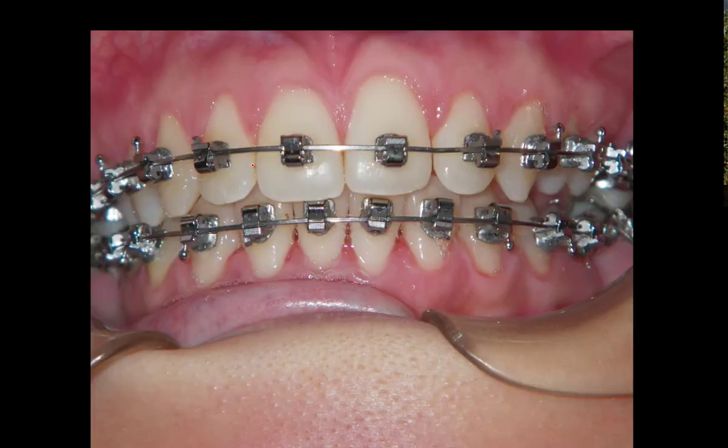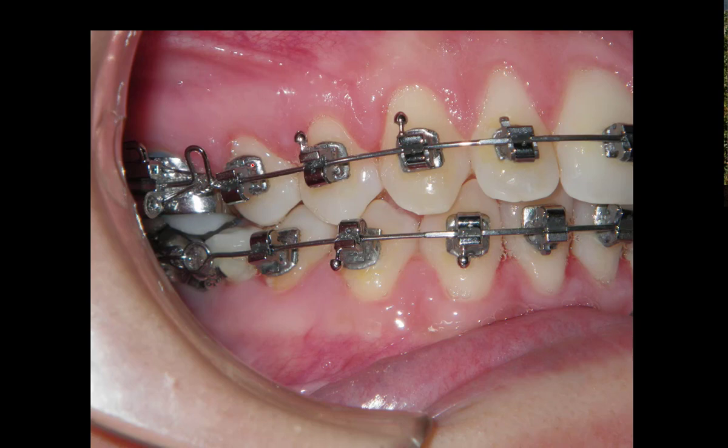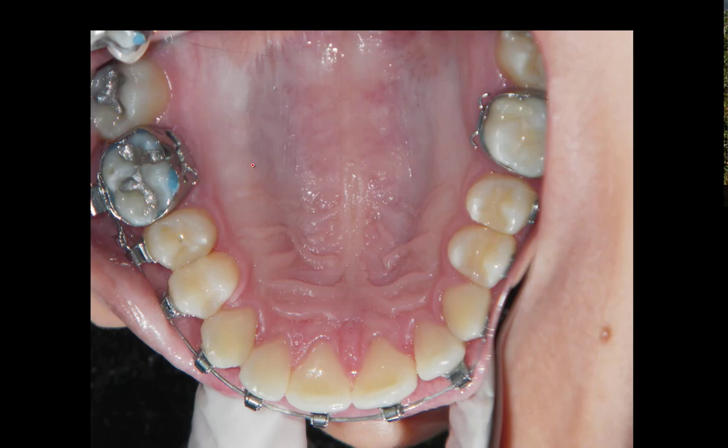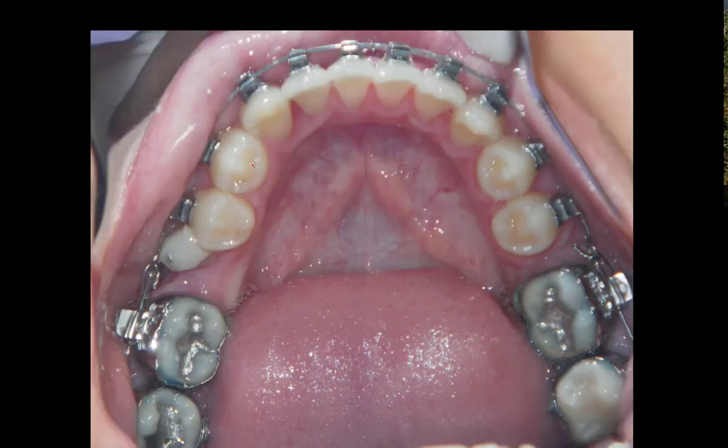This is 2010, and this is being done with the speed brackets, but I do not recommend them. They can work, but you don't gain a lot of speed with them, if any. The arch wires are tied back. Let's go through this pretty quick. That tooth is coming through — we've got to catch up over on this side; we're kind of behind over there.